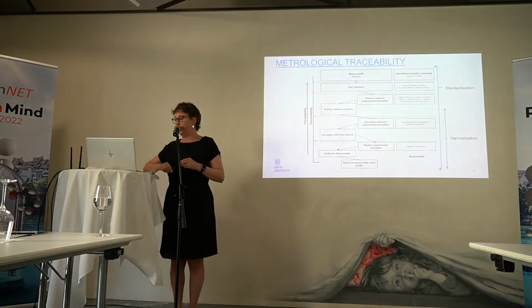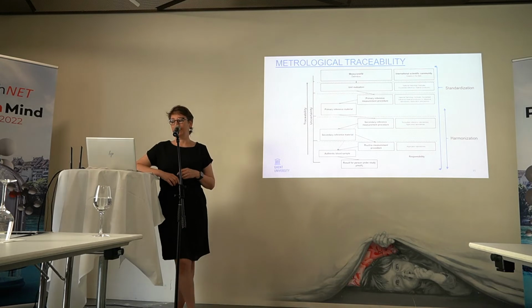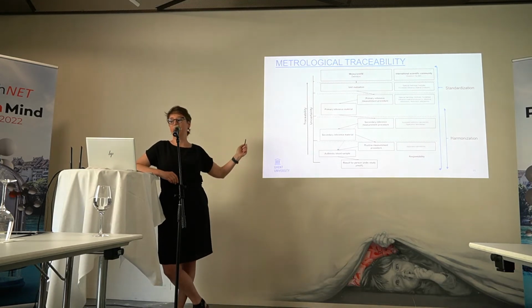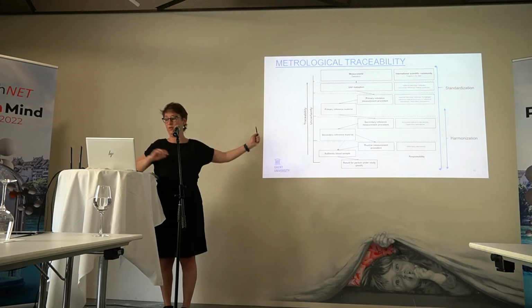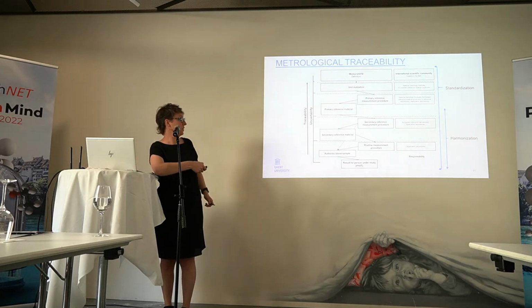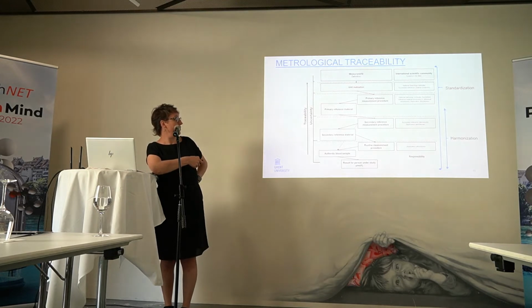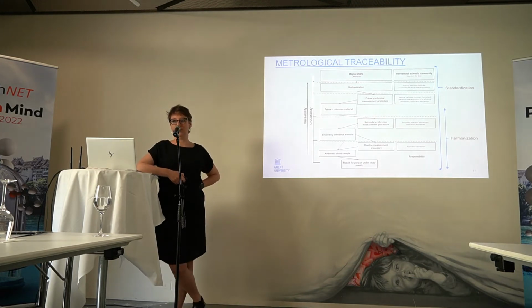So, metrological traceability. The ISO 17511 has schemes like this, 5 different schemes. The most simple one will start at the level of the secondary reference measurement procedure. So it will start here, down. Then you have systems which will start at this line, down, and then we have systems which will start here. And so we will have to define what we want to measure.